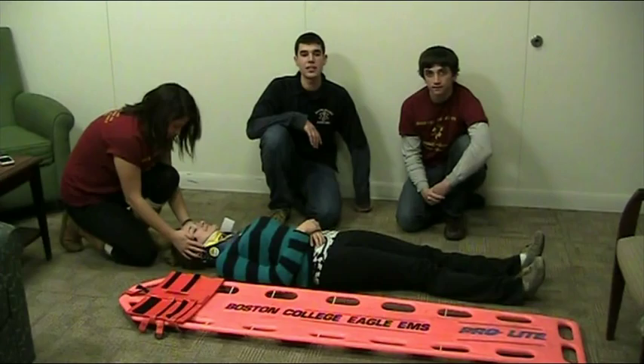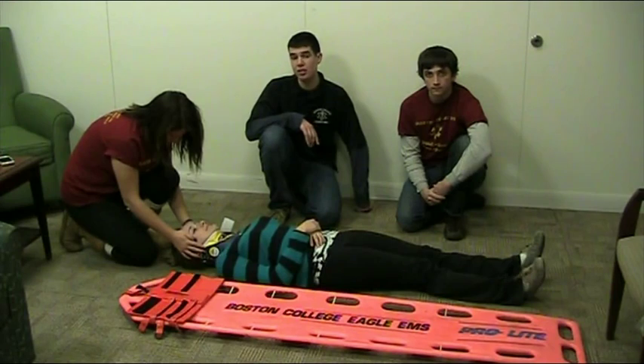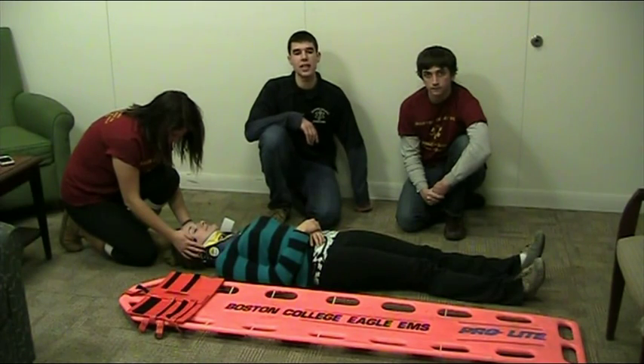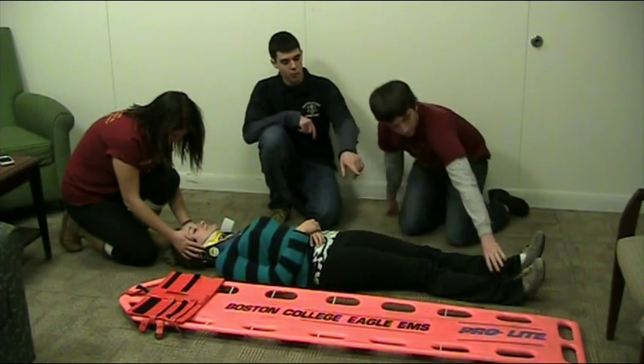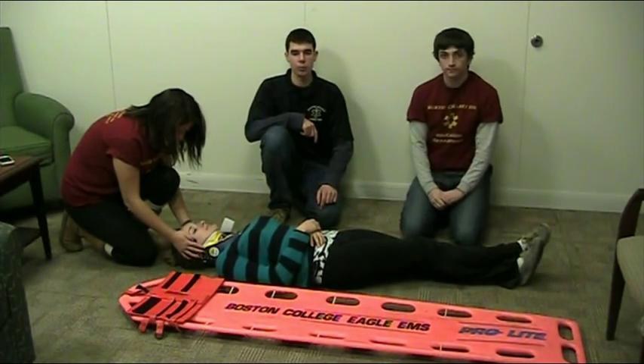After you have completed a rapid trauma exam and assessment and you determine that your patient needs to be properly backboarded, your first step is to hold C-spine immobilization, which Kristen is already doing. Then you should apply the C-collar, which is already done for us. The next step is to get the patient in the proper position to be log-rolled. Kevin is going to take one leg and put it over the other so that we can get even better leverage when moving the patient.